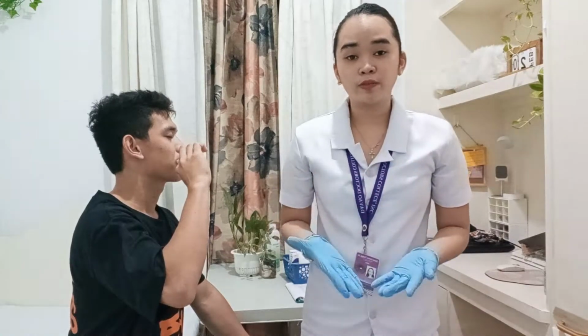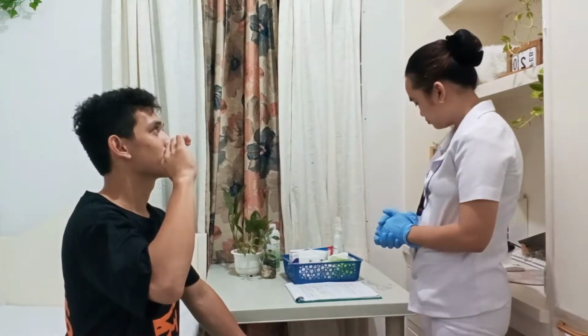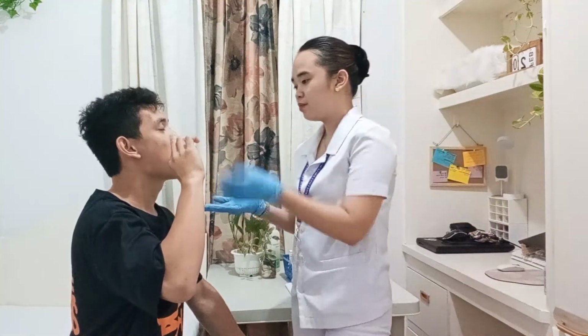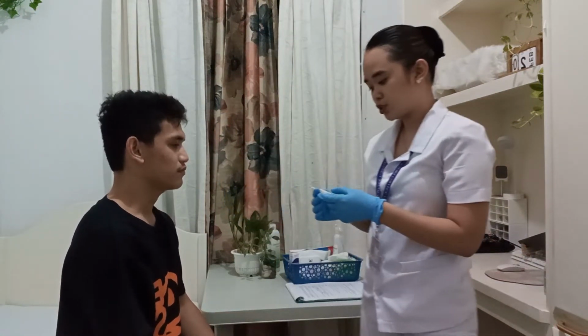So the electronic thermometer will indicate the complete reading through a light or a tone. Now we will wait. Now that we can hear the tone of the thermometer, it means that it is done reading the patient's temperature. Can you open your mouth, Mr. Patrick? Okay. So your temperature is 36.5, which is a normal temperature.